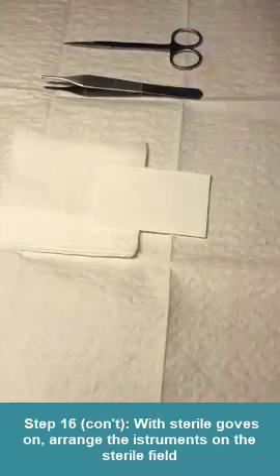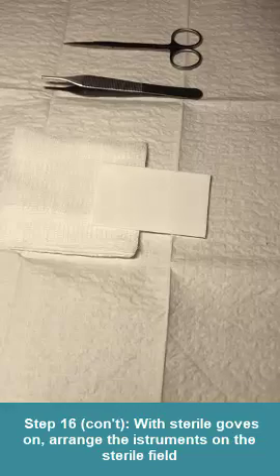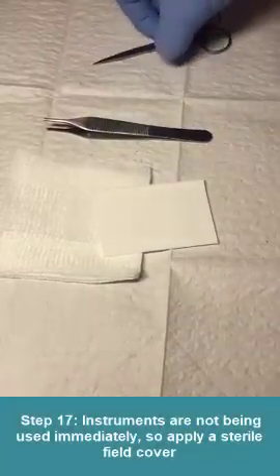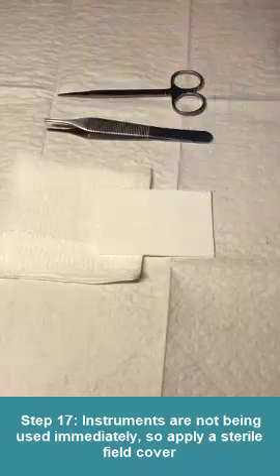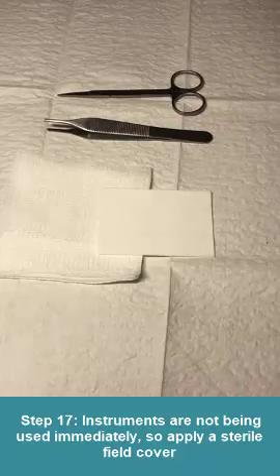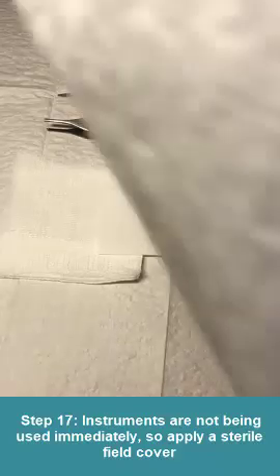Now, if I were going to stay in the room and watch this, it would remain sterile as long as no one reached over it or to the sides, or correction, brushed up against it. But in this case, I'm going to leave the room, so I'm going to take the second drape, and just like I put the drape onto the flat surface to start with, I'll unfold it and I'll put the drape over the instruments just by dropping it on there. And then that is ready to be used in the foreseeable short future.